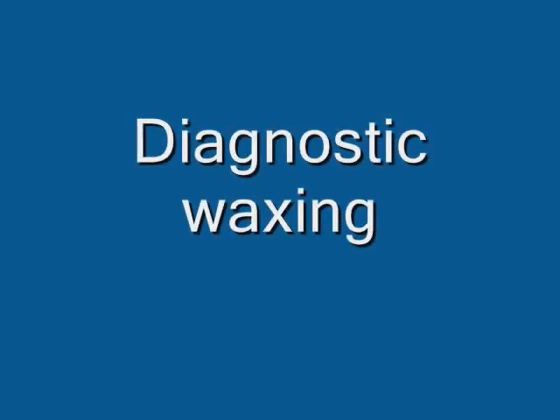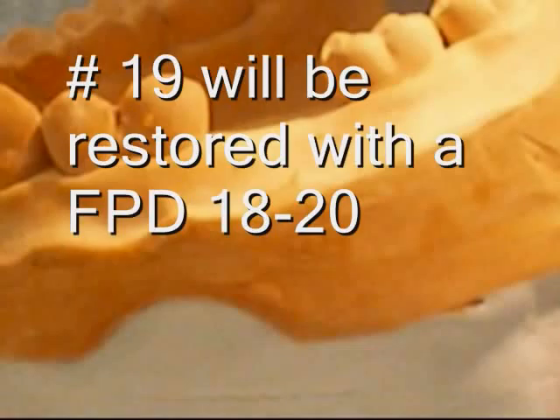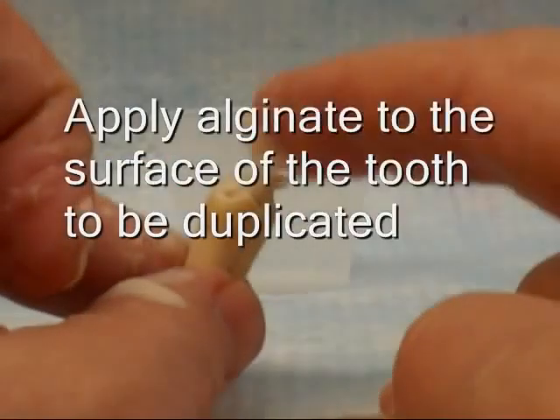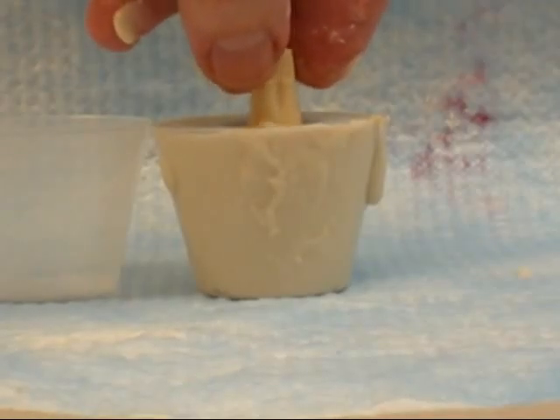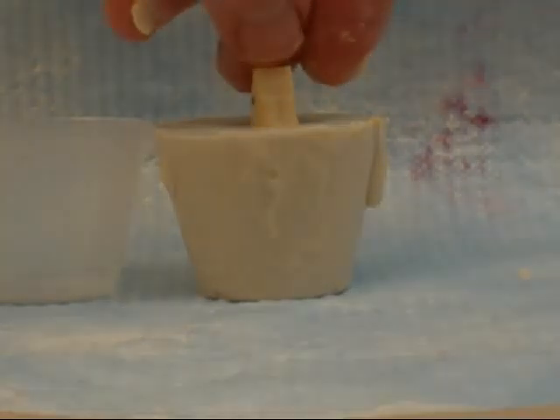The diagnostic wax-up is performed prior to any fixed prosthodontics case, where alteration of the tooth contour is indicated. Pontics may be fabricated by duplicating a tooth in alginate, and using incremental placement of monomer and polymer as shown. Blue wax may also be used.